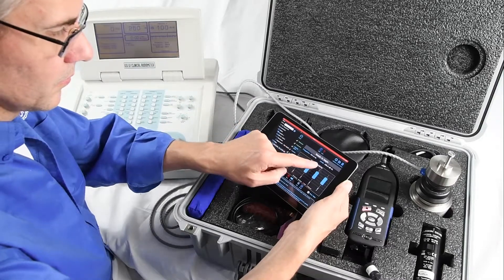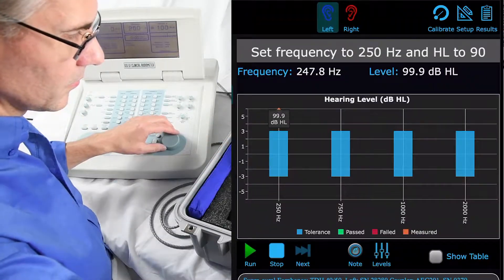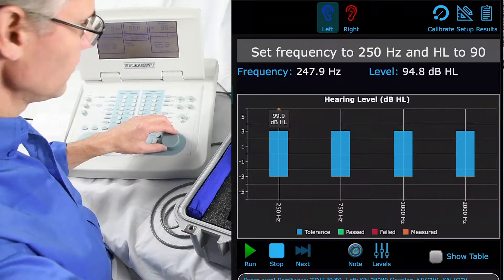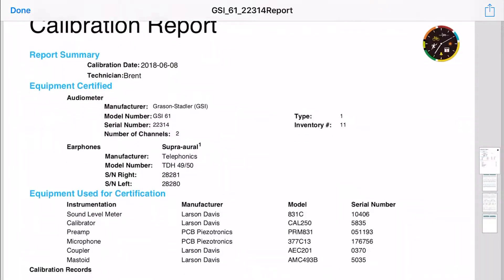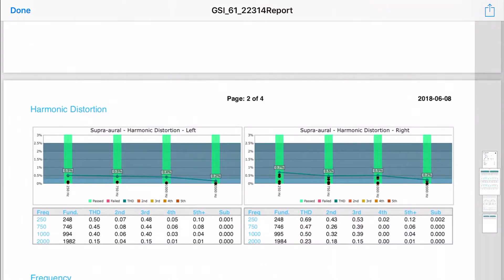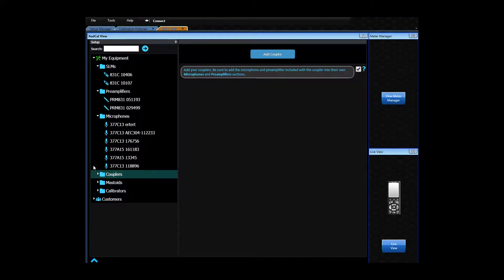It's more than measurements. The AudCal option is robust software for running tests, generating reports, and making testing easier with a stored database.